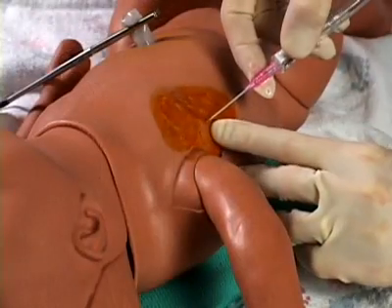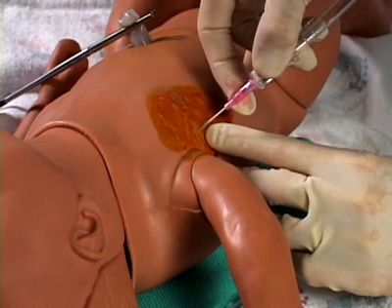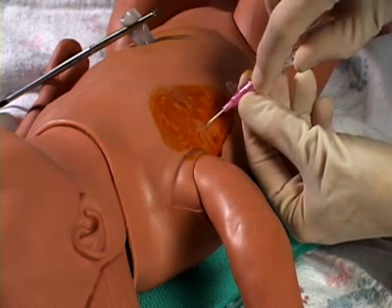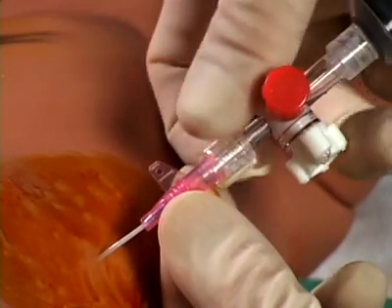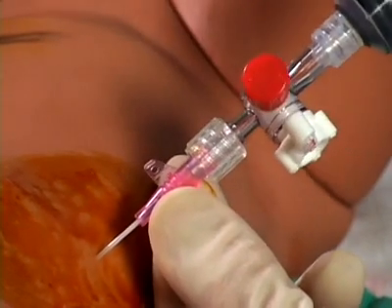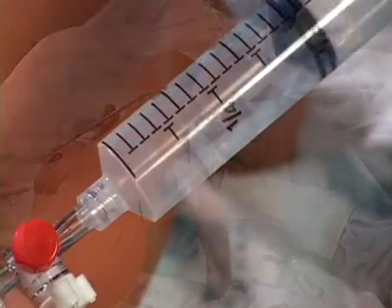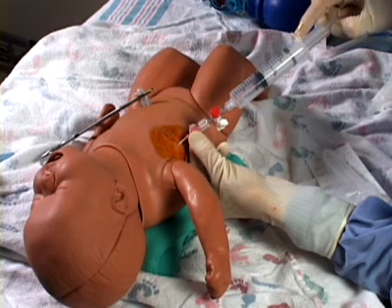An 18 or 20 gauge percutaneous catheter is inserted perpendicular to the chest wall just over the top of the rib in the fourth intercostal space at the anterior axillary line. The introducing needle is then removed and the catheter is connected to a length of tubing, a three-way stopcock, and a 20 milliliter syringe. The stopcock is opened and the syringe is aspirated to remove air.